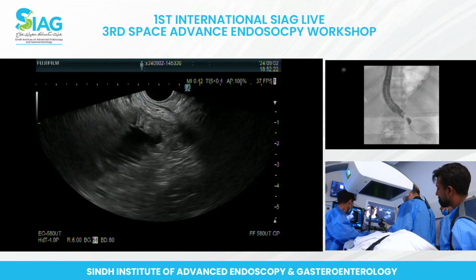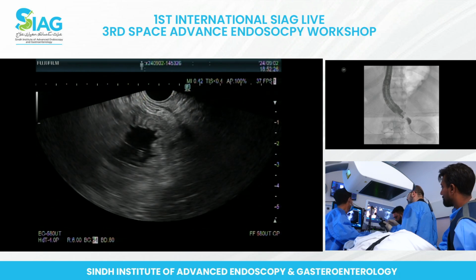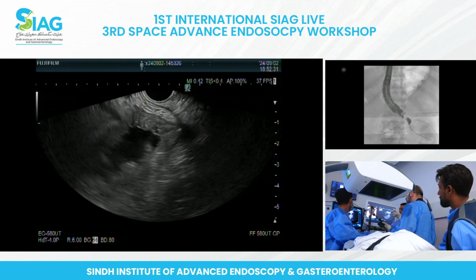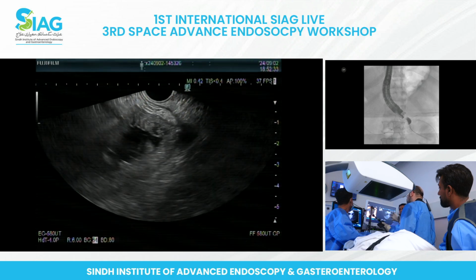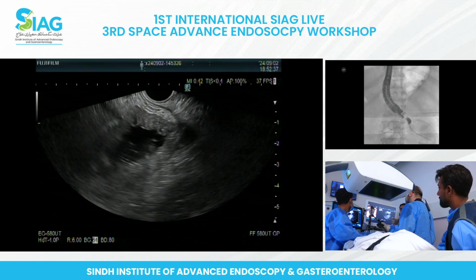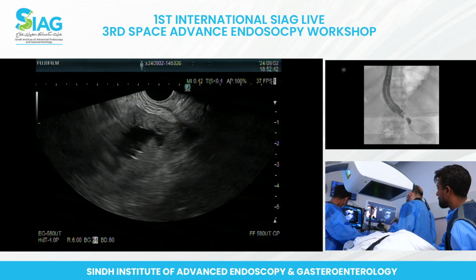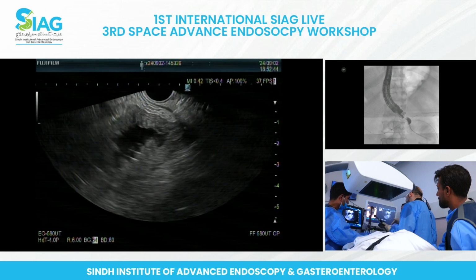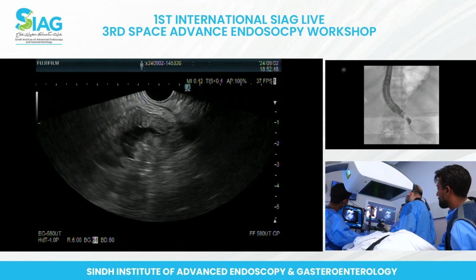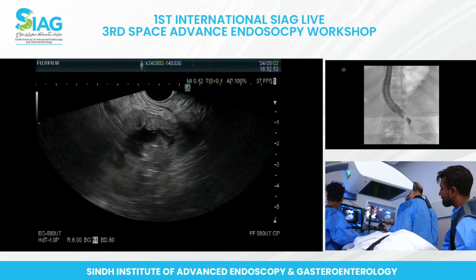So just as a recap, the steps are, and I don't know if you can see my handle, step 1 is to, under cautery, advance the catheter into the bowel. Step 2 is you lock it and you deploy the distal flange. That's your most critical step. Then once you visualize it, you can pull back on that distal flange from the small bowel and you can deploy your proximal flange. So right here I feel pretty good about this.